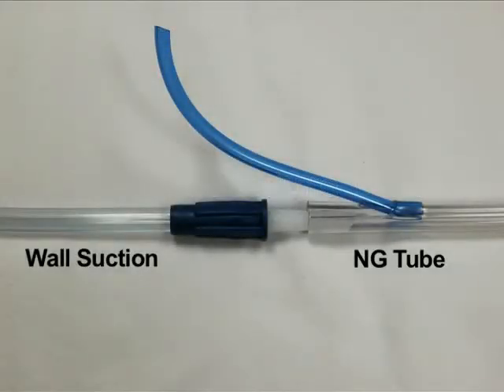The nasogastric tube can remain on wall suction if needed for the surgical procedure, or can be placed to gravity after decompressing the stomach.